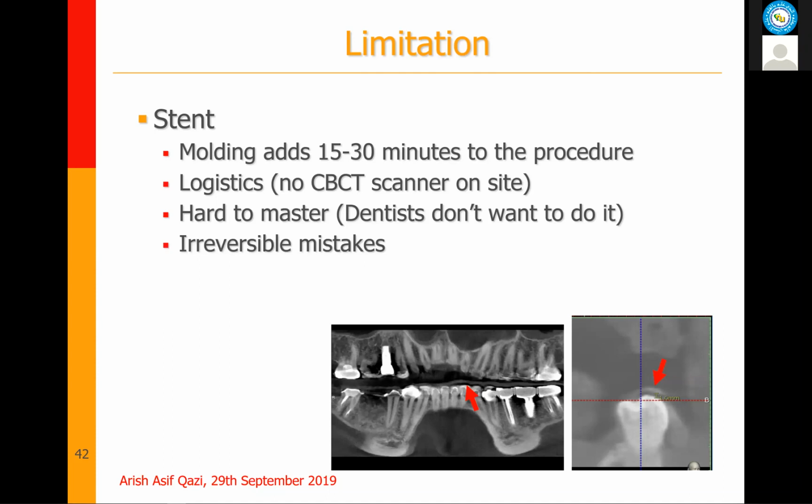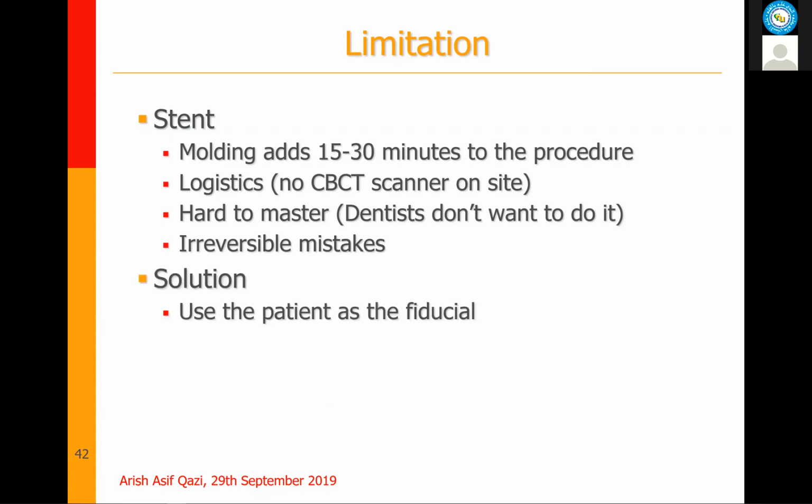So for example, this is a stent molded onto the patient's teeth, and you can see the stent is not fitting well, like it's in the air, and this would lead to accuracy issues during drilling. So we immediately reacted, and instead we completely developed a new methodology for registration. This methodology is completely new. Nobody else has a similar technique or technology in the world right now.